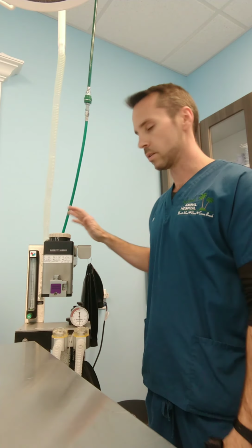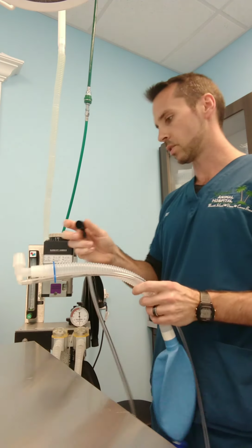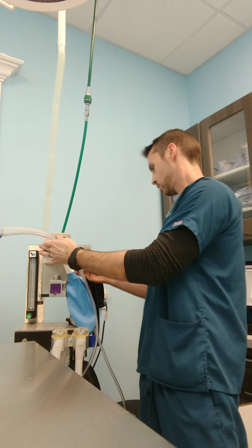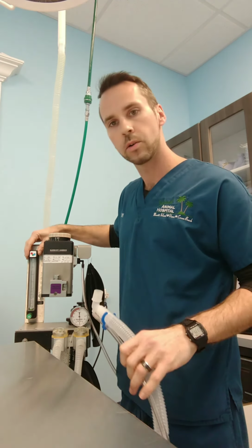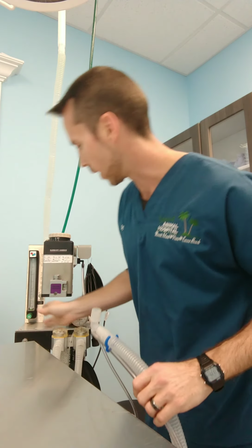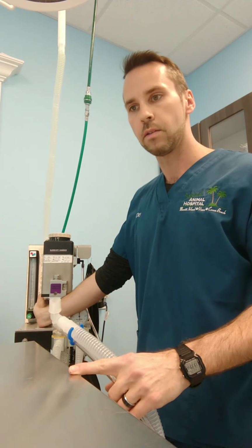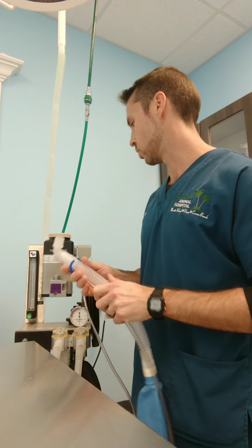Okay, so this is our anesthesia machine. We have our non-rebreathing system right here. So this hose hooks up to the machine. We have our flow meter, which controls the flow of oxygen to the patient. Next to that, we have the O2 flush valve, which sends fresh oxygen directly to the patient.